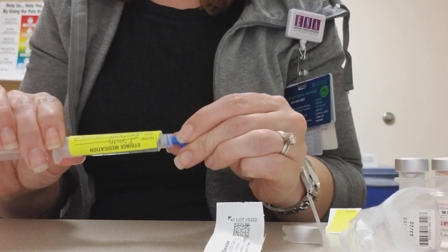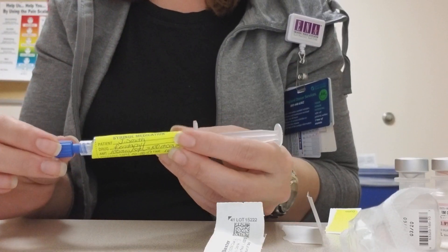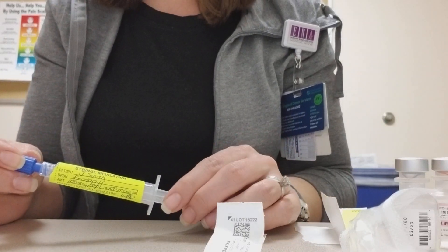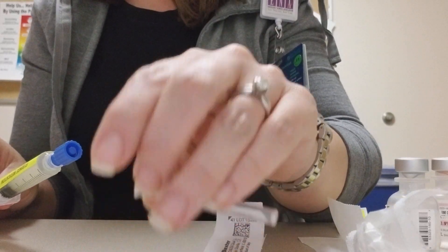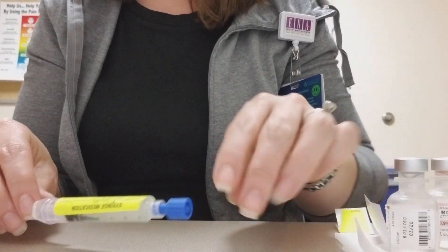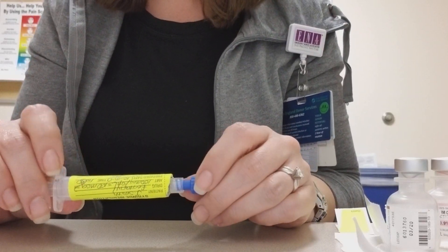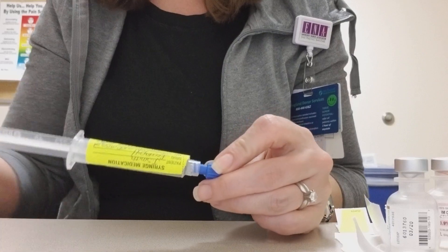And this way, using this syringe, it can't ever be confused with the flush, which adds safety as well. And you're done — it should be that simple. This will be a big practice change, but I think once we all get used to it, we'll all agree that this is going to be a much safer practice for our patients. Any questions, just let me know. Thanks!